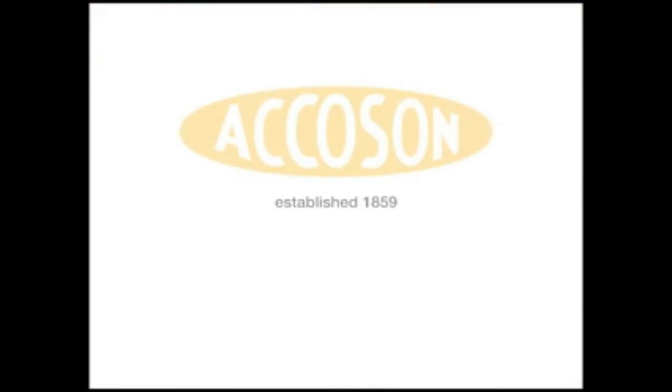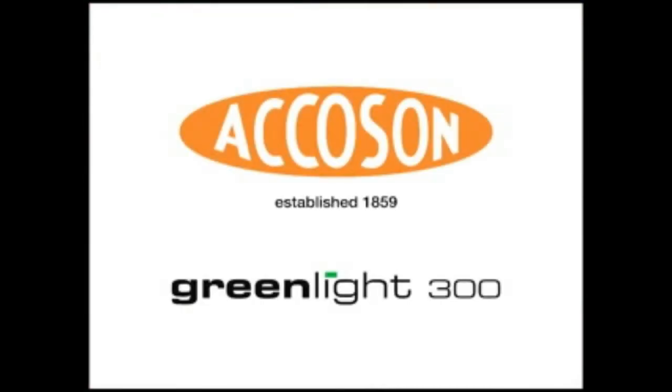The Accoson GreenLight 300. Accuracy, confidence, self-calibration. All without mercury.